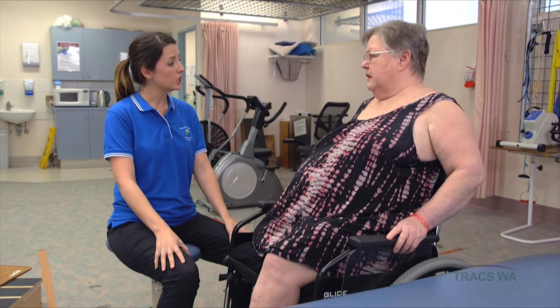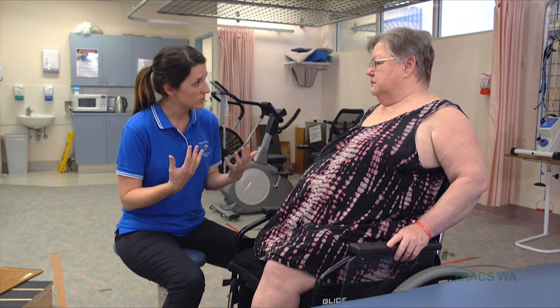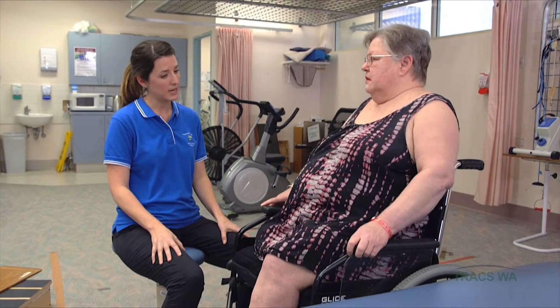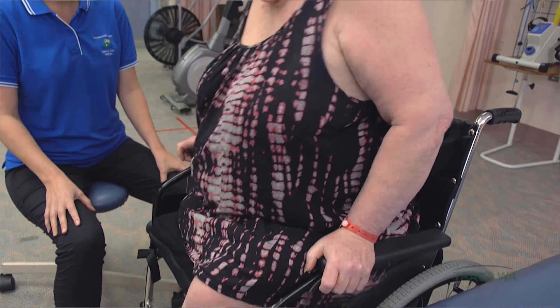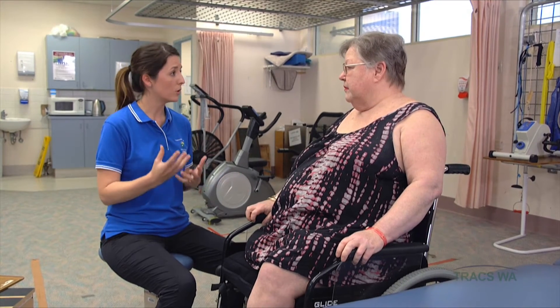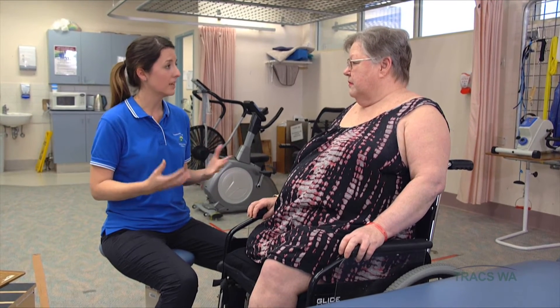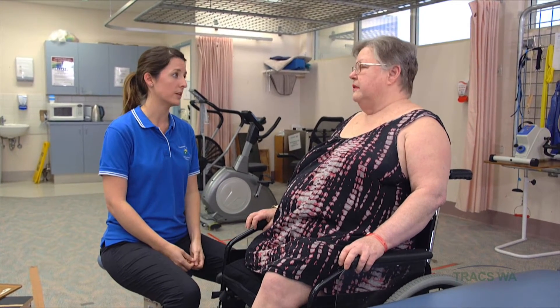The other technique you can do sitting in the wheelchair is to try to bring your body forward. What that purely does is just change your body posture and your position in the wheelchair, again just helping the blood supply get through to all of those areas.